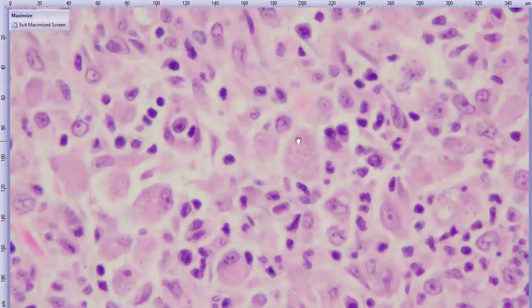Ocular histoplasmosis is typically a manifestation of systemic disease. These cats will typically inhale the microconidia, and then it will disseminate to various organs, the eye being one of the classic ones where we can see it. It typically is not quite this florid, at least in my experience. I've had to go on quite the bug hunt in the past, so this is a nice one for me, not for the cat itself.